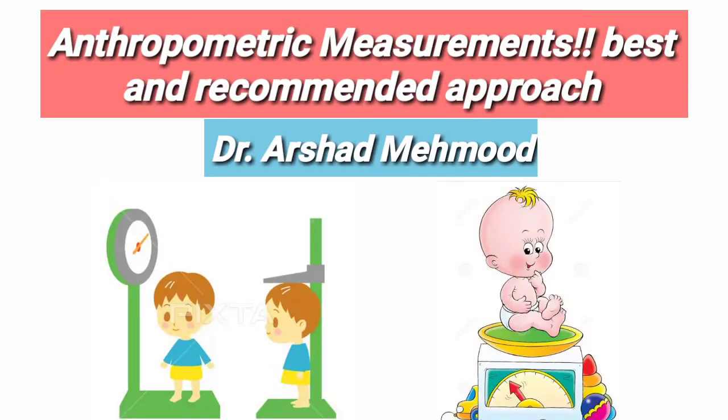In this video, we will be discussing a very important topic in pediatrics, that is anthropometry, and how we are going to take the anthropometric measurements as per the guidelines. So this is very important for a pediatrician to take a good height, weight, and measurements as per the recommendations of anthropometry.